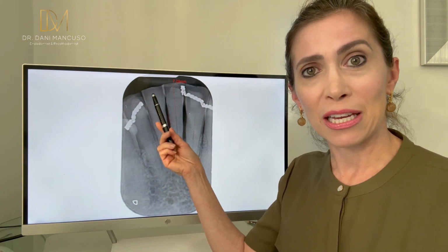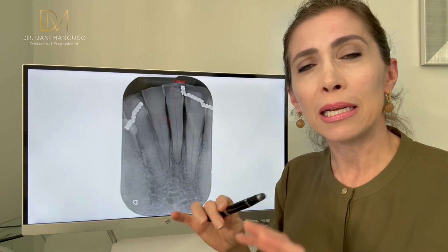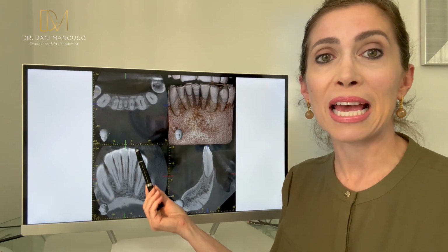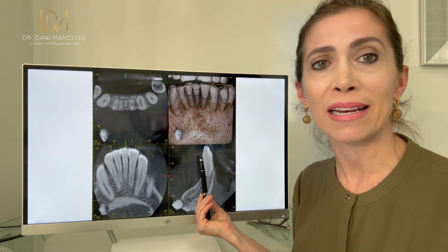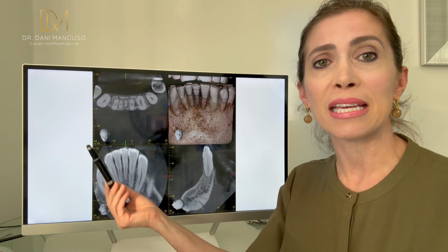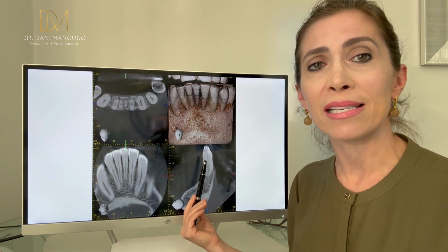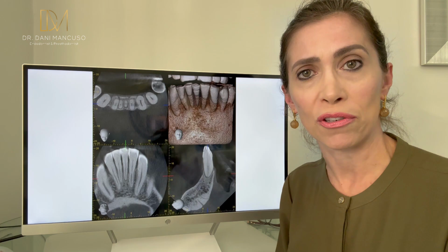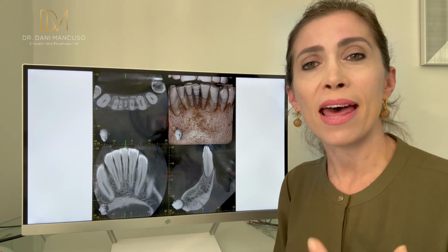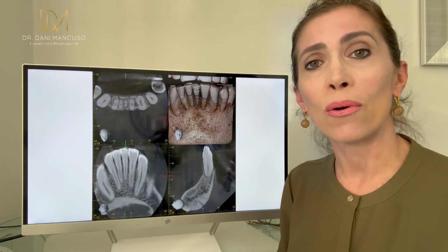So the first thing I'm going to say to you is measure from the incisor edge to the visible part of your canal, at least for you to have an idea. If you have a CBCT, then it's much better, of course, because it's more real in three-dimensional. You can see where the canal is, the most part that is calcified, and then the visible part. You can see in different views. You can pre-measure more accurately. So in this case, there is a faded line. It looks obvious to you, that line, but just be careful because the calcification inside can be less dense, and then the canal looks like the canal is there, but in reality that's all calcified. So let's try to find it.